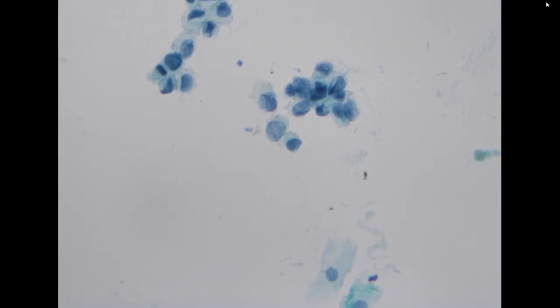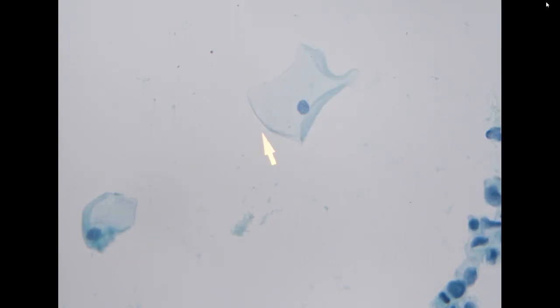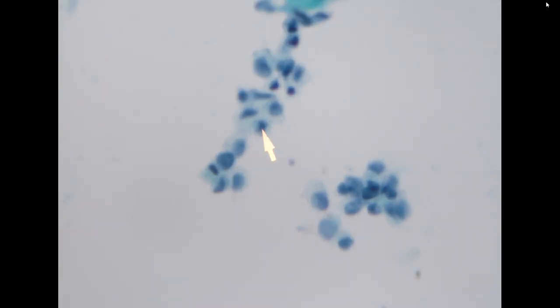The cells here look more hyperchromatic. So we have some other cells adjacent to compare. So this is an intermediate cell of the urothelium. This is also a urothelium intermediate cell. So these are benign urothelium cells, and these look more hyperchromatic.